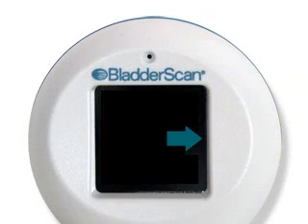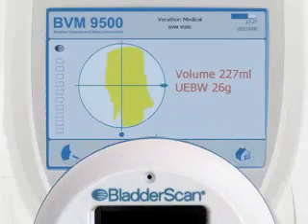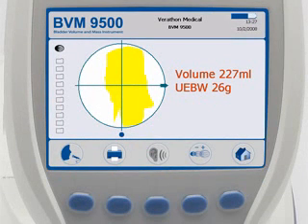If the arrow on the probe screen is solid, you are slightly off target and must re-aim and re-scan. The console screen will show a green arrow indicating the direction to re-aim.